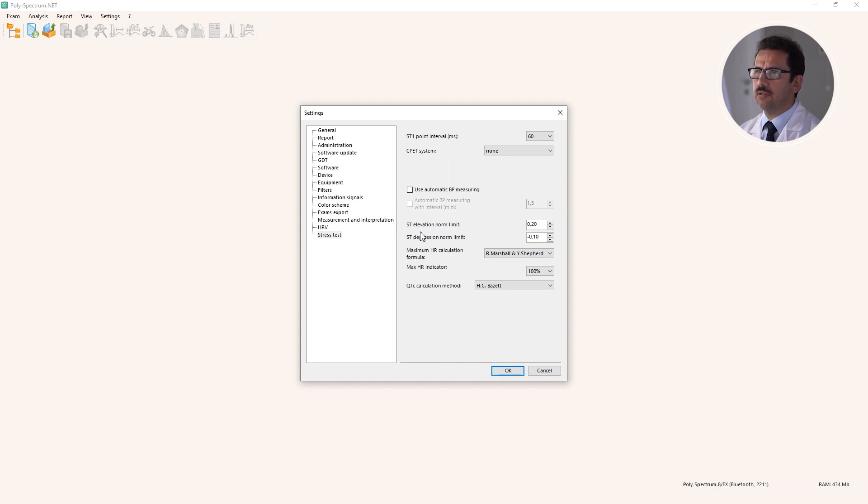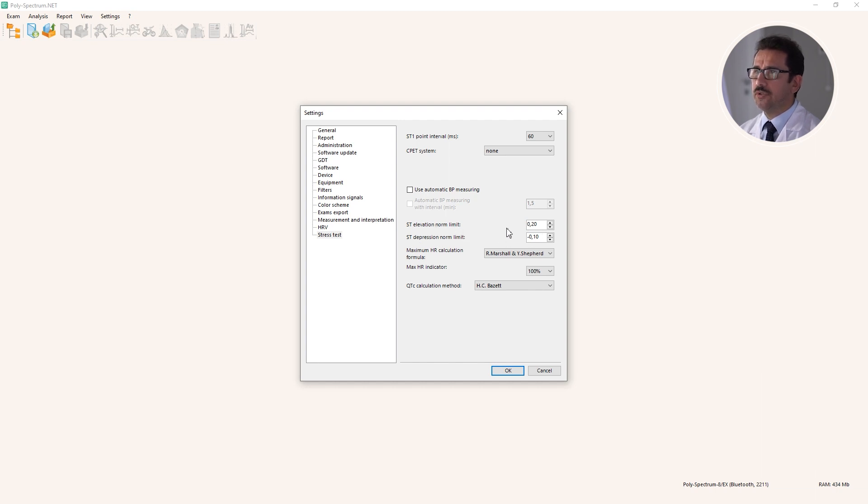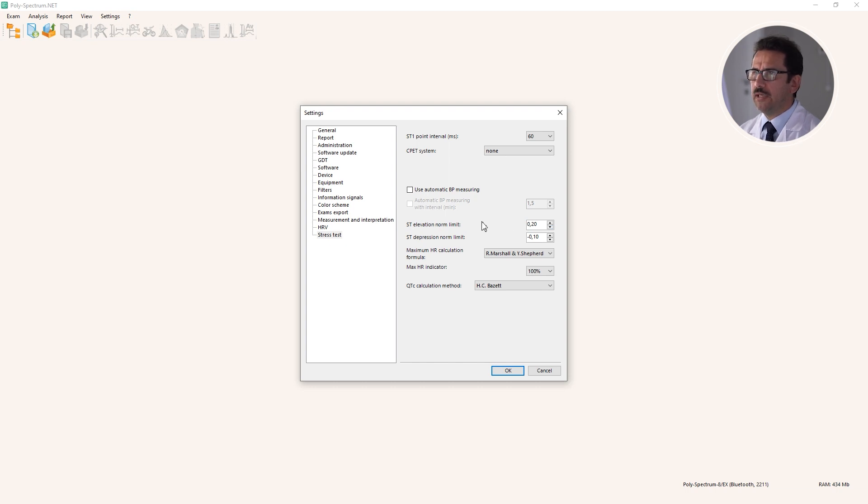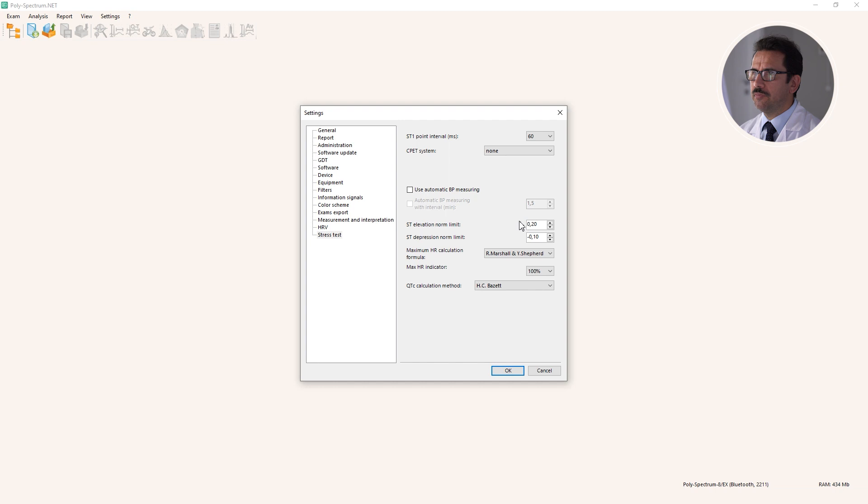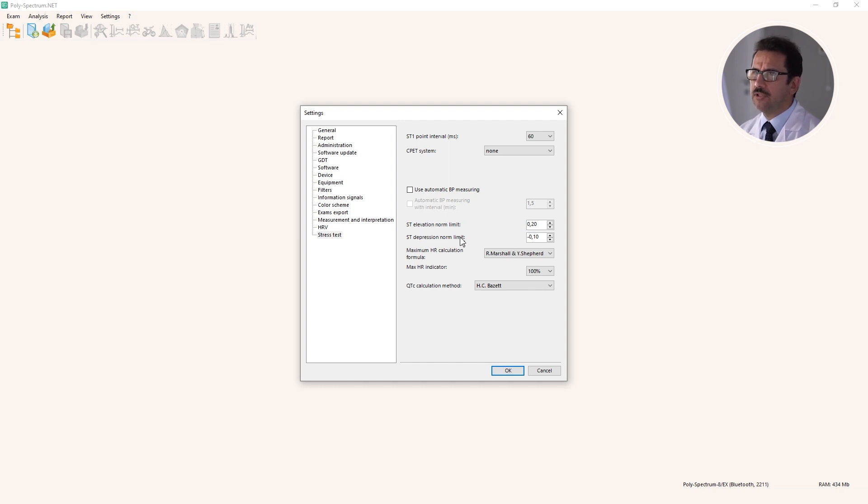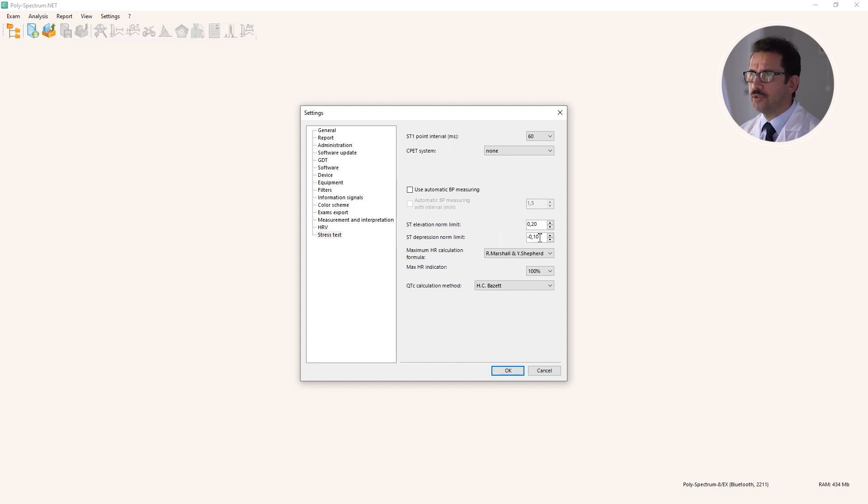You can change the elevation depression limit for ST segment. These two limits are very standard and have been in use for many years, but who knows - maybe next year some European Society of Cardiology may issue new guidelines and say, 'Okay, now ST depression is not 0.1 but 0.15.' No problem, you can change it in the software.